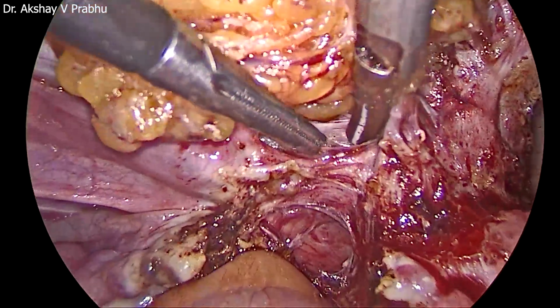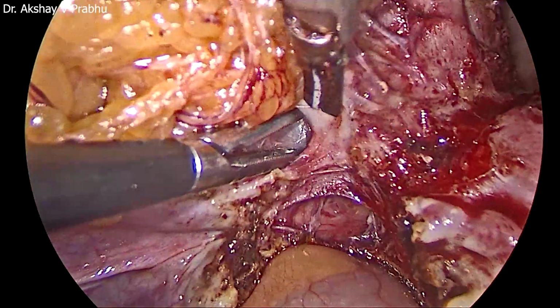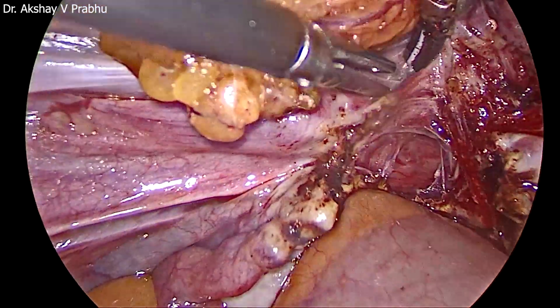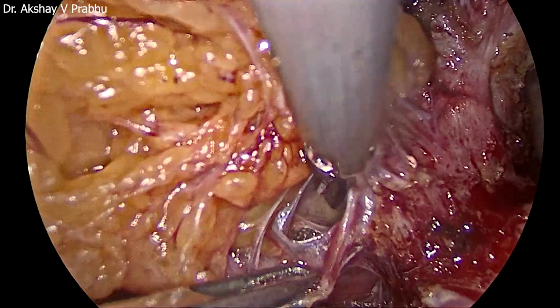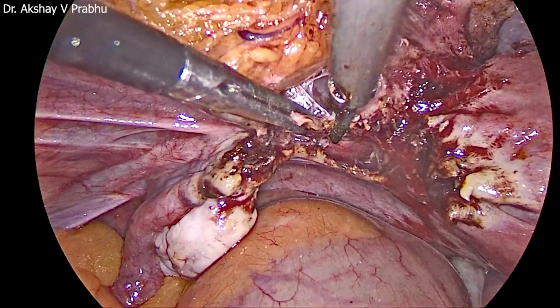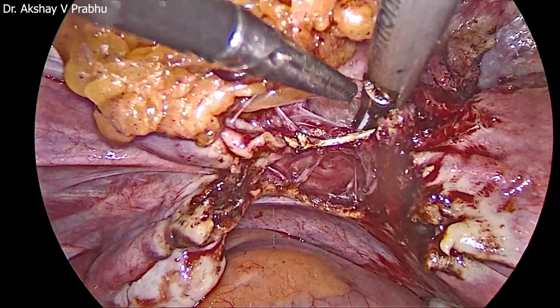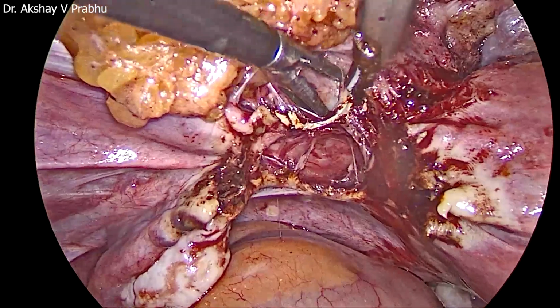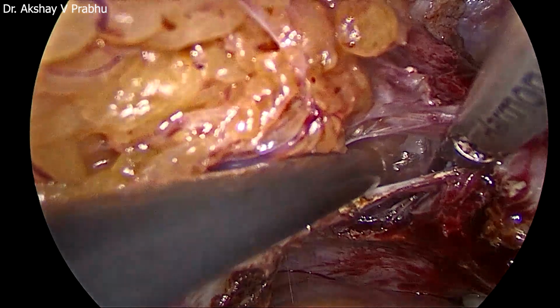If you can see, we are entering certain virgin planes now. The mark of a virgin plane is intact areolar tissue. So you can see that in that plane vascularity is less. There is some intact areolar tissue. So now I've got a better idea. I'm cutting the tissue band. It's actually an extension of the broad ligament. Now I have kind of reached a plane which is sub or infra bladder region.